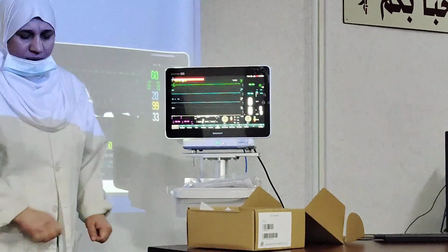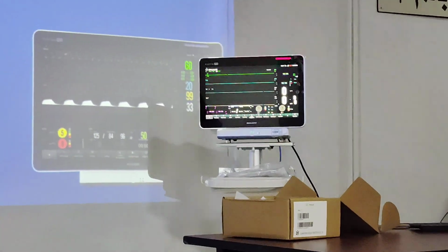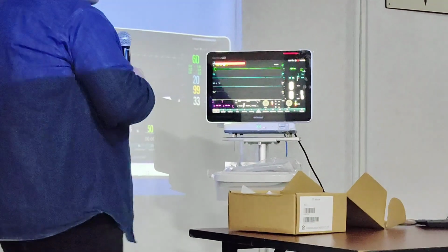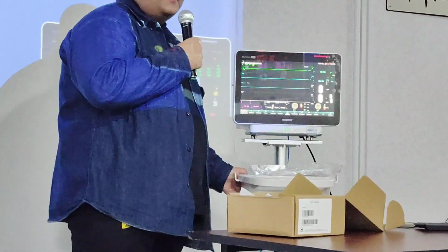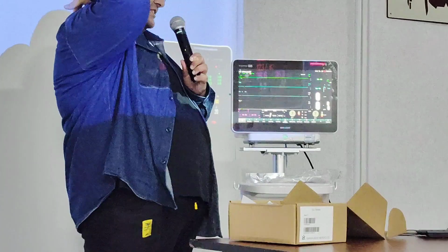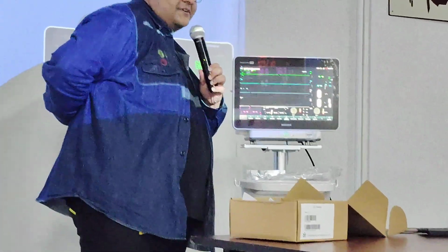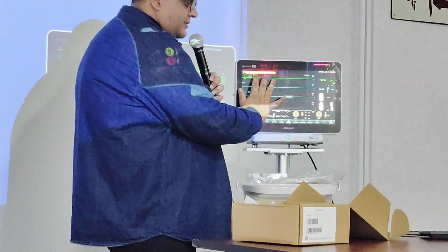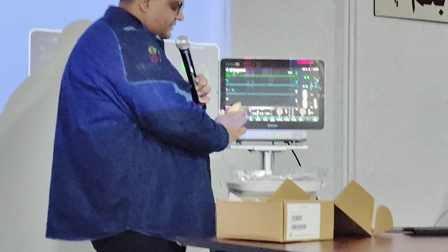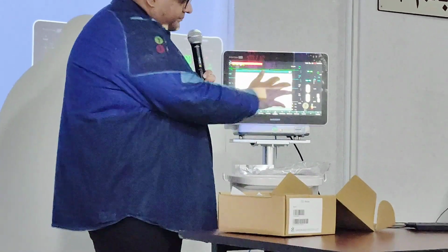Yeah, so it's very important because you should think of this monitor screen as your back, okay? If you touch someone on the back, they can't tell if you're touching them with one finger or two fingers if they're very close to each other. So you want to spread them apart a little bit to be able to tell the monitor whether you're using two fingers. So if I do one, it thinks it's just one finger. Okay? All right.